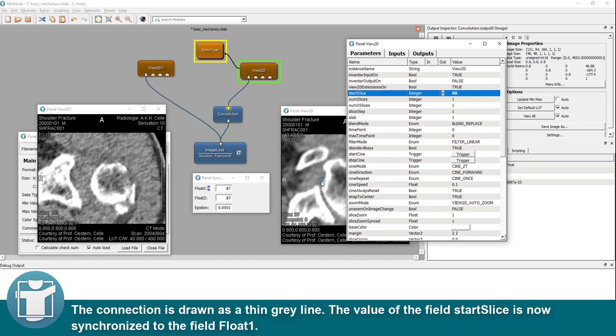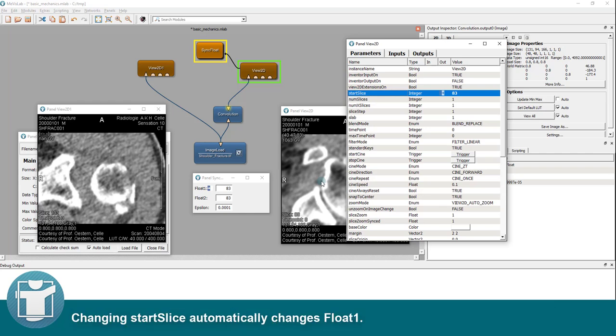The connection is drawn as a thin gray line. The value of the field start slice is now synchronized to the field float 1. Changing start slice automatically changes float 1.